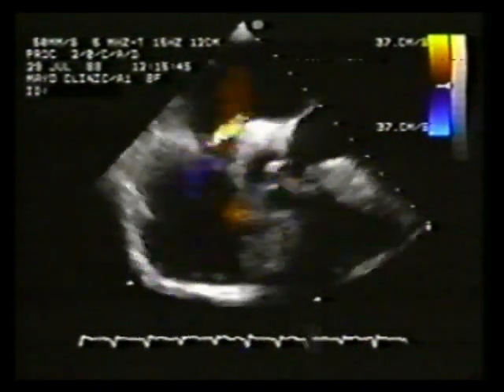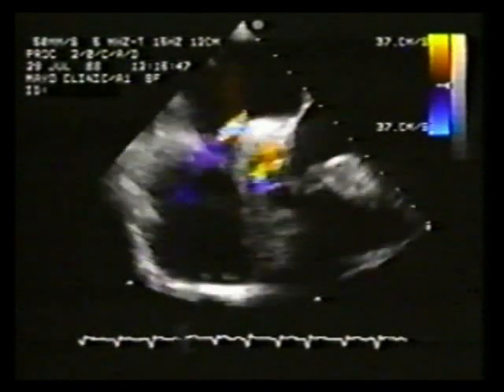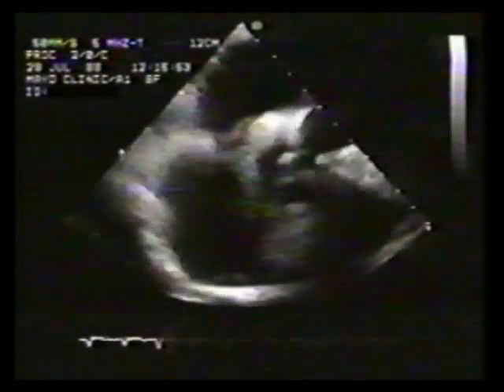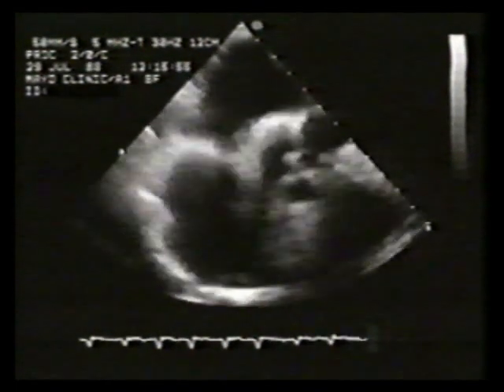This is indicative of shunt through a patent foramen ovale. These patients are presumed to have a higher incidence of paradoxical embolism. Contrast echocardiography can also assist in the detection of right to left shunt.